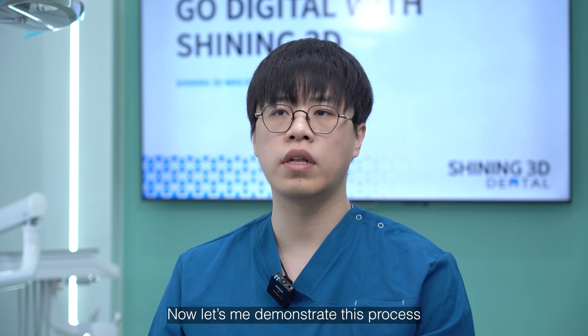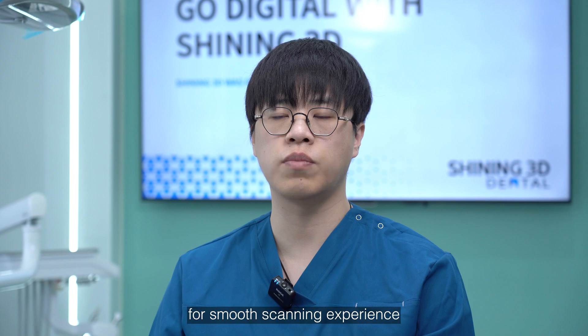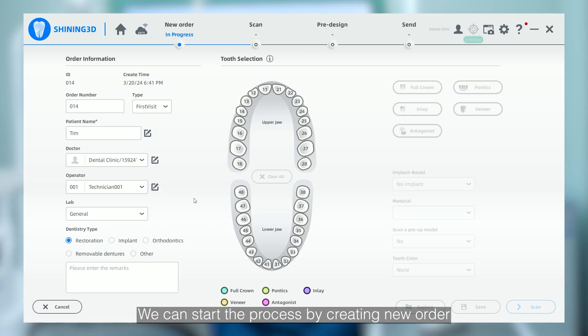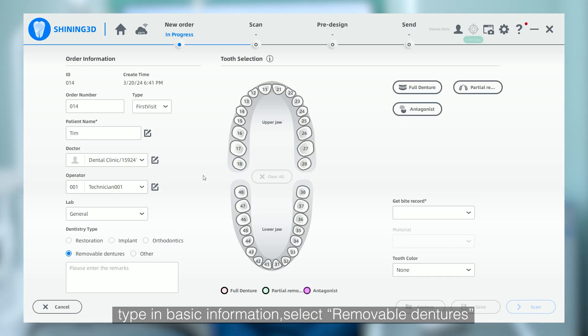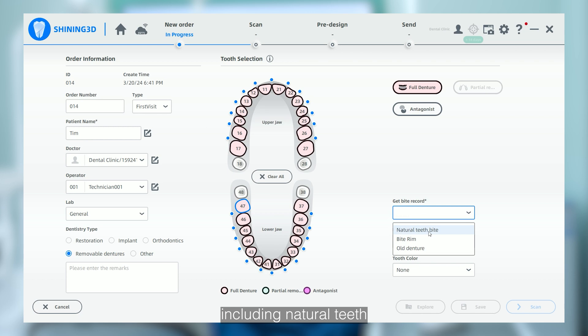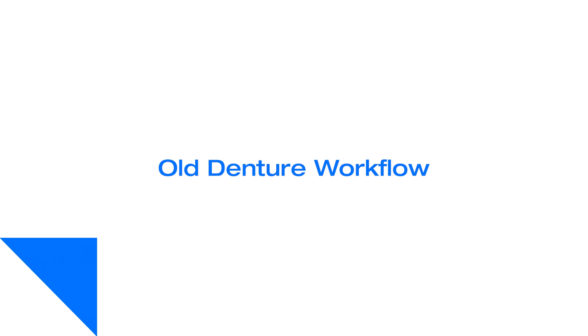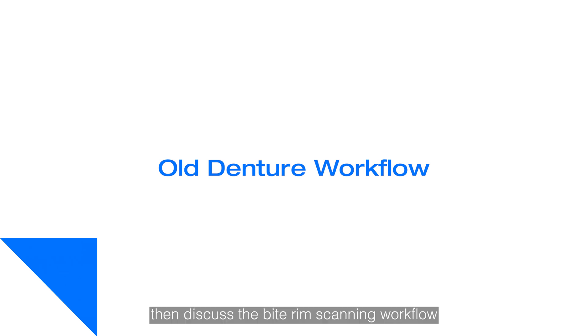Now let me demonstrate this process to you and share some useful tips for a smoother scanning experience. We can start the process by creating a new order, type in basic information, and select removable dentures. We provide three methods for users to record a bite, including natural teeth, bite rim, and old denture. In this video, we will first talk about the old denture scanning workflow, then discuss the bite rim scanning workflow.